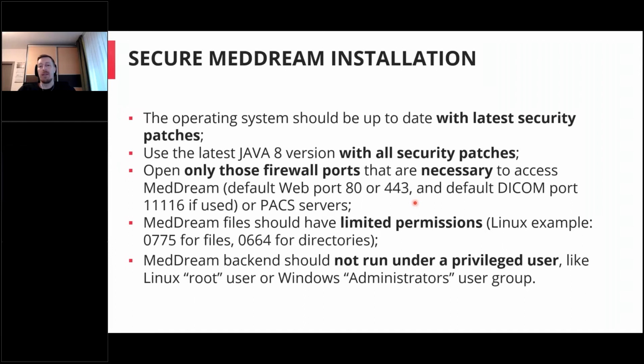And for the files, you should also limit the permissions. For example, in Linux, have 775 for files and 664 for directories, so other users wouldn't be able to manipulate the files and directories.